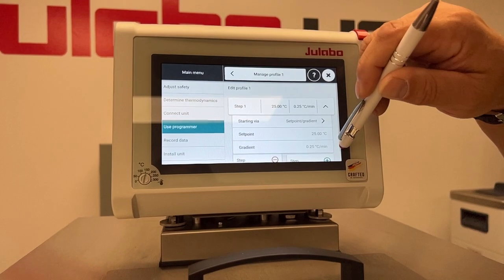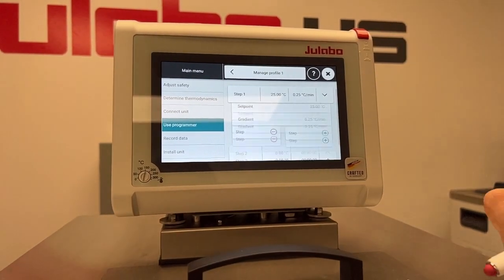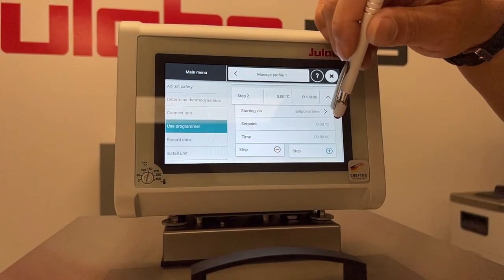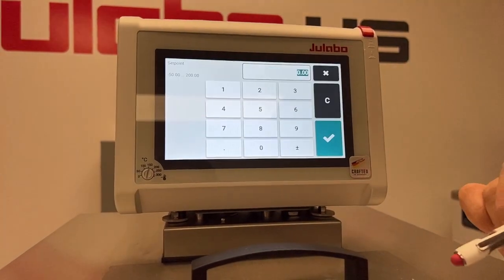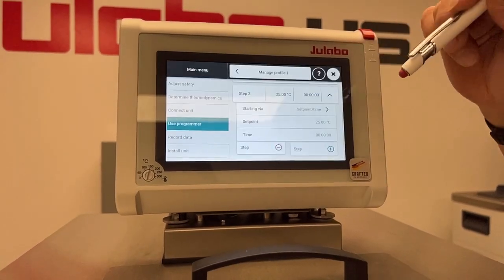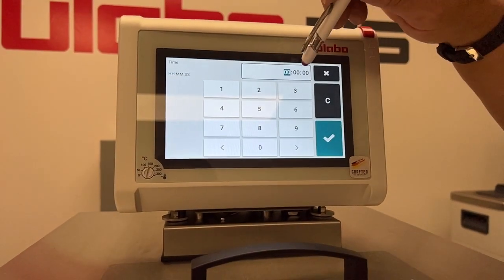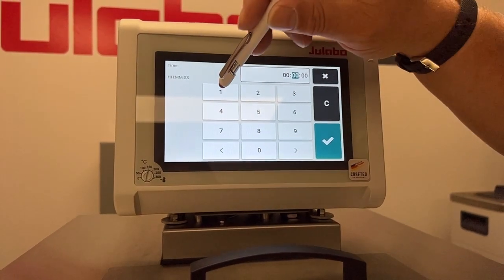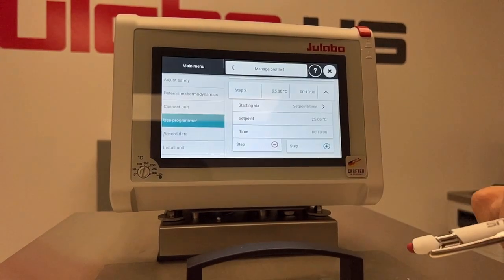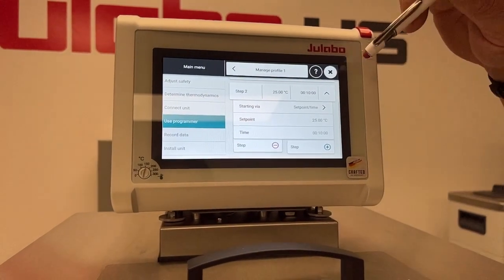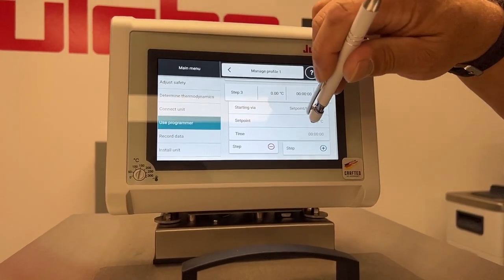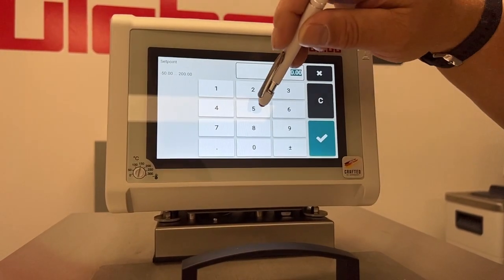Then to add your next step, you click the Step Plus. Now you'll see it's Step 2. Let's say we're going to stay on setpoint time this time and set it for 10 minutes as a hold step. Then again, next step, we'll do another time.